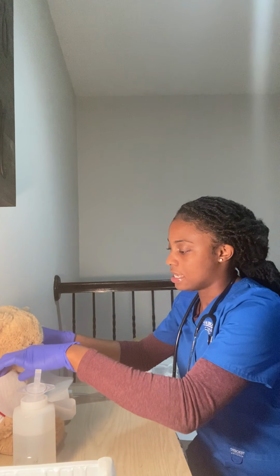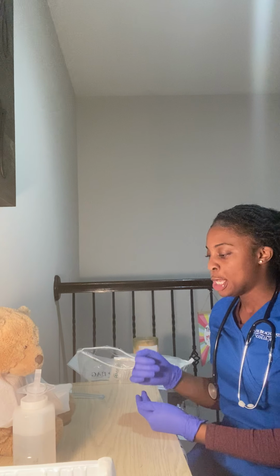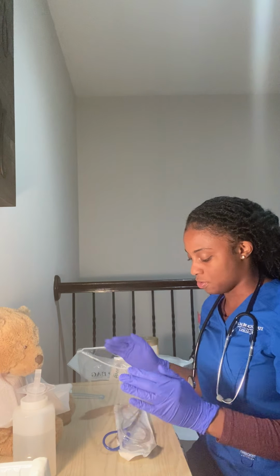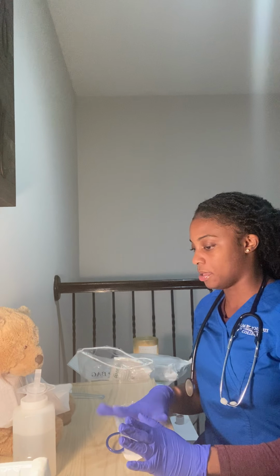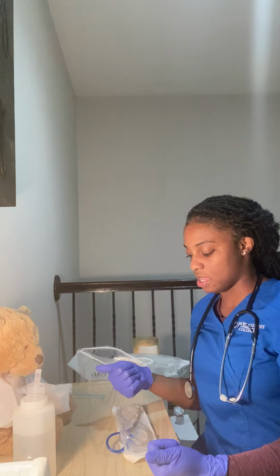Okay, now that I've got that done, I've already got my patient draped for the procedure. I've already let them know what we're gonna be doing and what the NG tube is. So now I'm gonna go ahead and get ready to start. My patient's been having some appendicitis and they've been feeling very nauseous because of it. So we're gonna go ahead and get the NG tube placed for surgery. I've got my lubricant and everything all set up here. So before I do that, I'm gonna ask my patient if he has any allergies. He doesn't have any allergies.